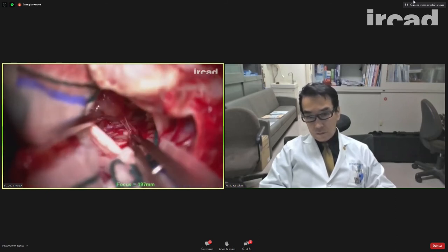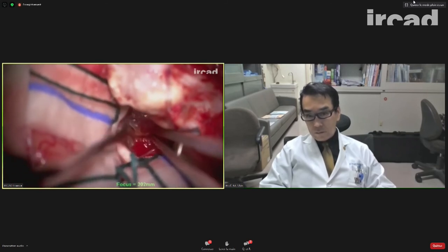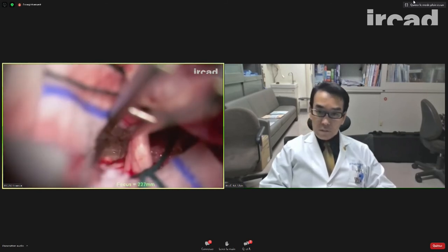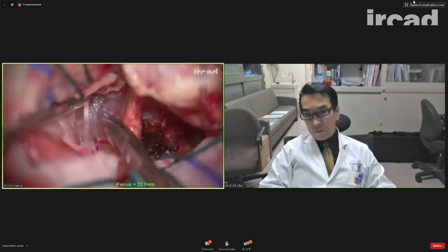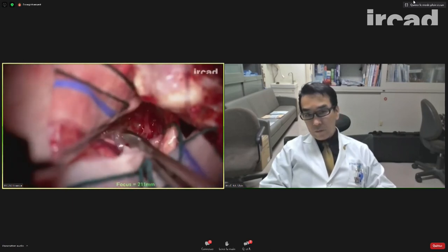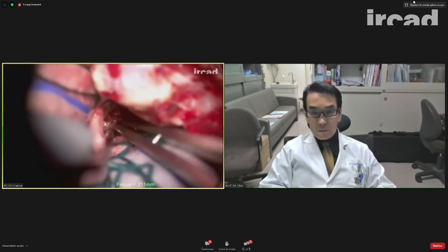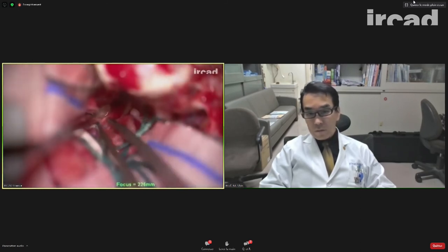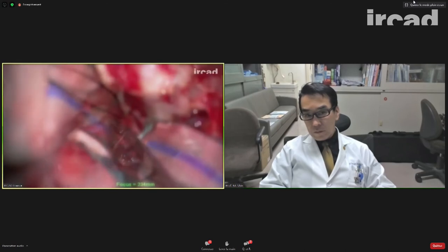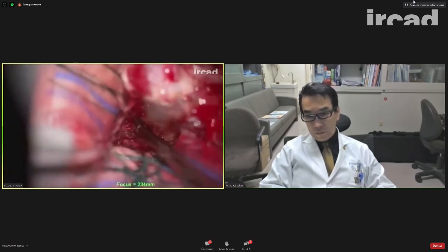She was intact postoperatively, except that she had a facial nerve paresis that she recovered from after a few weeks post-op. But otherwise, she was intact. We were also more comfortable to peel the tumor away from the brainstem. And you see that it was quite adherent to the brainstem.